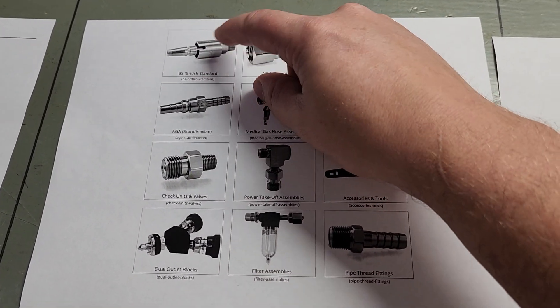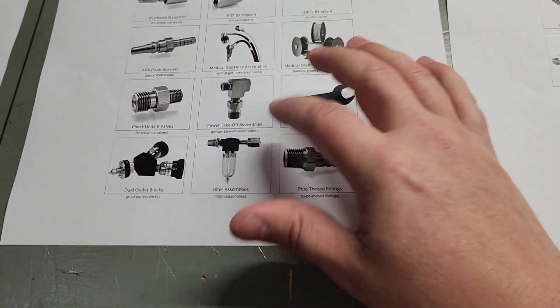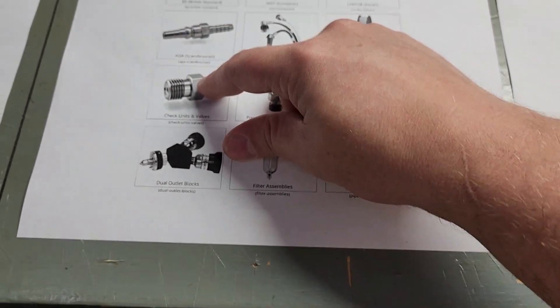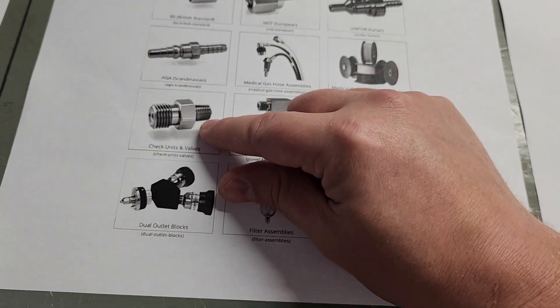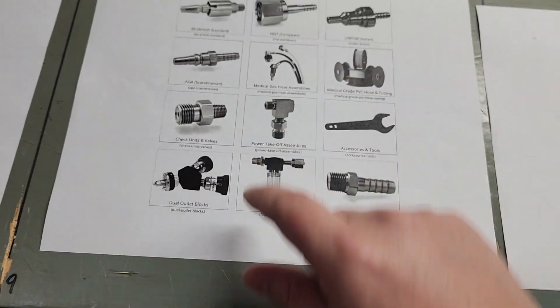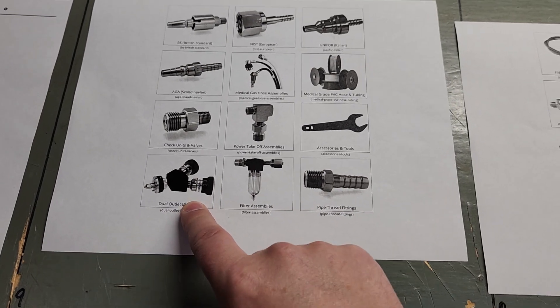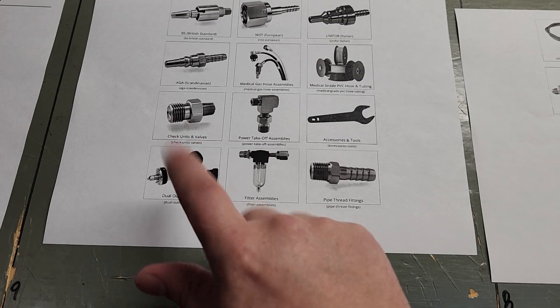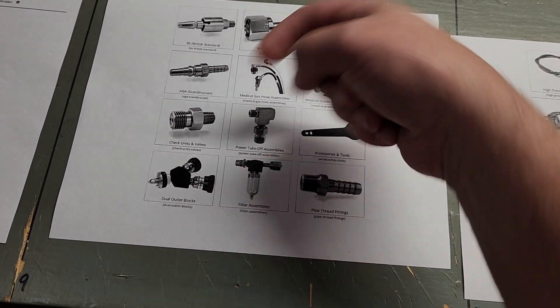DIN, haven't seen any of those. Ninety-degree swivels—that's an option. So when you get to nitrogen, then you start seeing stuff like this BS, the British standard. There are whole different types of connections you can get. Quick connects, check valve units—instead of getting a loud blast of air when you disconnect something, check valves. We can put check valves in your hoses. Dual outlet blocks.